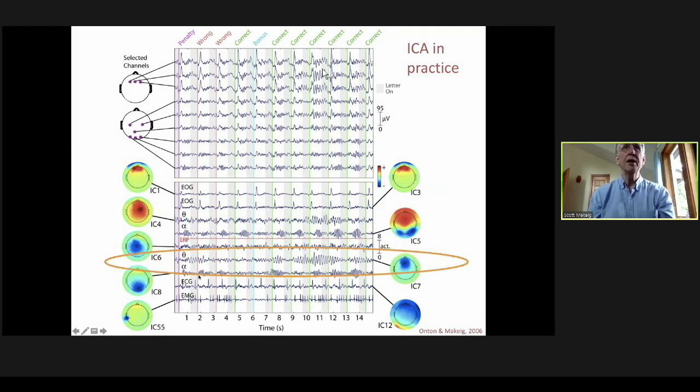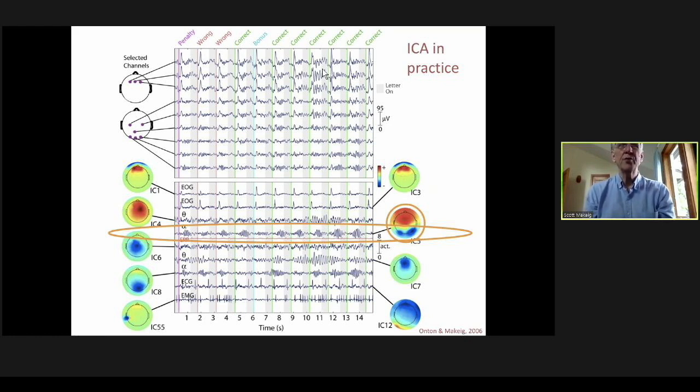Here is a frontal midline theta during a stretch of good performance of the subject who is doing a difficult two-back task. And here is another theta outburst in right frontal cortex during portion of this. And here is a bilateral alpha activity. So the subject blinked after every trial, and then there was a waiting period of maybe 500 milliseconds before the next stimulus appeared. And in this lateral occipital or parietal area, bursts of alpha appeared. That's what I call alpha flooding.